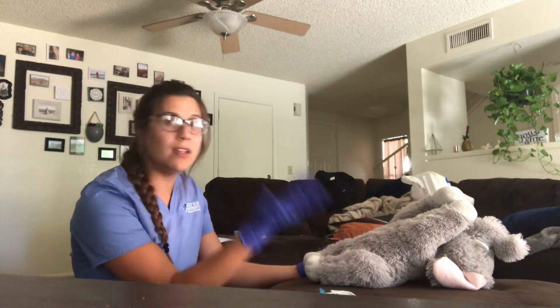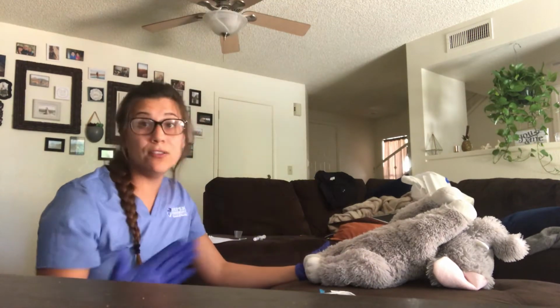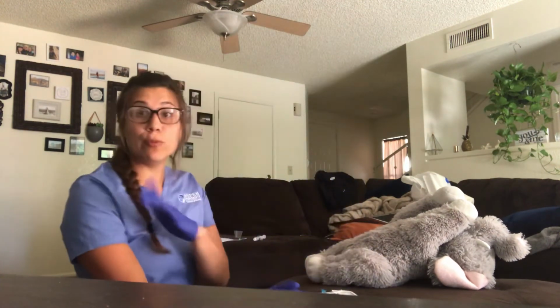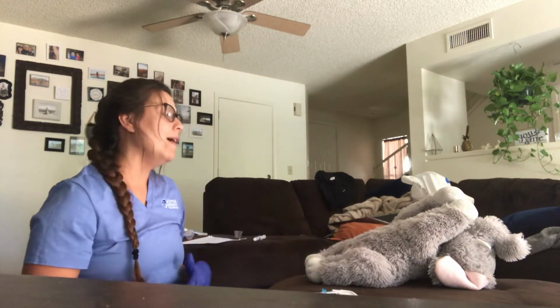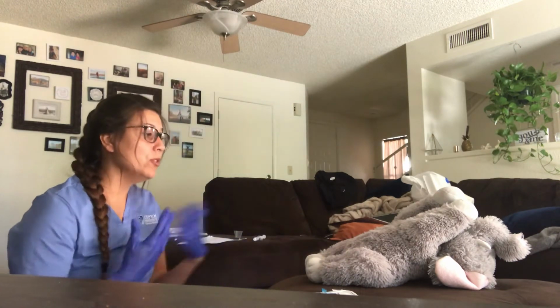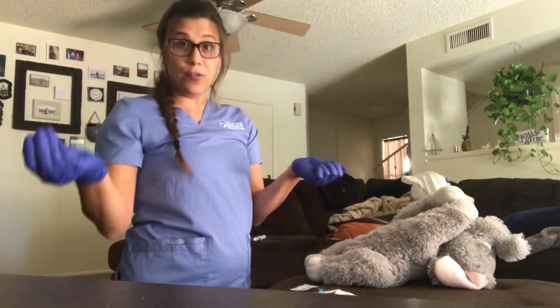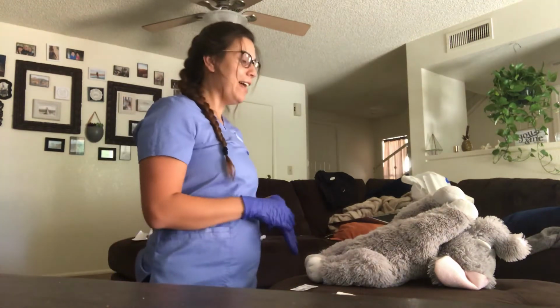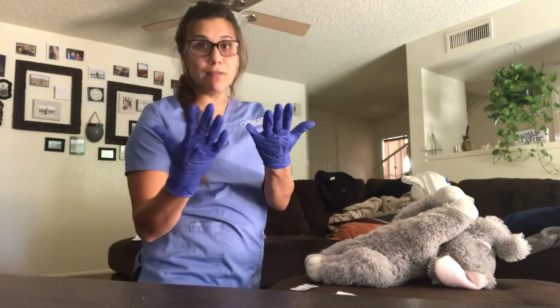You're now going to choose the legs or the thighs. Of course, before you do this, you also want to check the MAR to make sure where the last injection was given. The nurse before you maybe gave it in the arm, so you don't want to do the arm again, you always want to rotate. You can also ask the patient, where was your last injection given? So once you choose your site, we're doing the abdomen. You're going to want to remove these gloves and put clean gloves on, because you're putting an injection in somebody's body. You don't want to cross-contaminate anything. So you remove your gloves, put new gloves on.